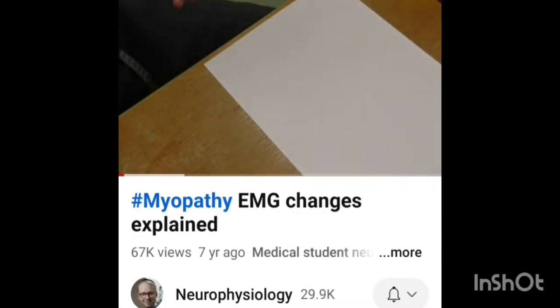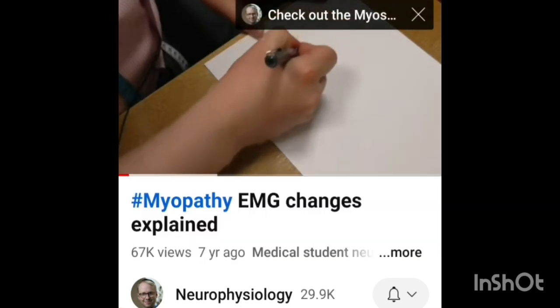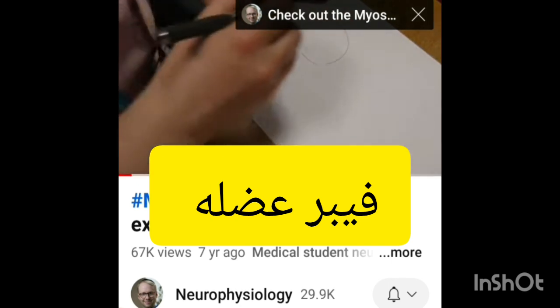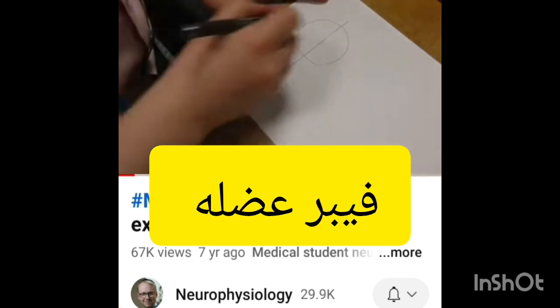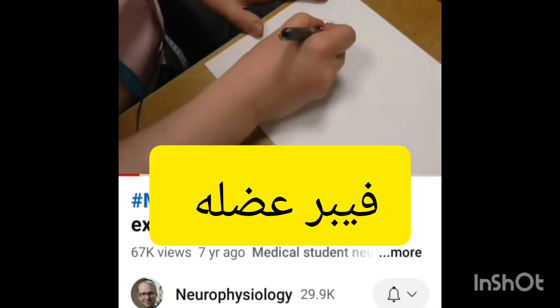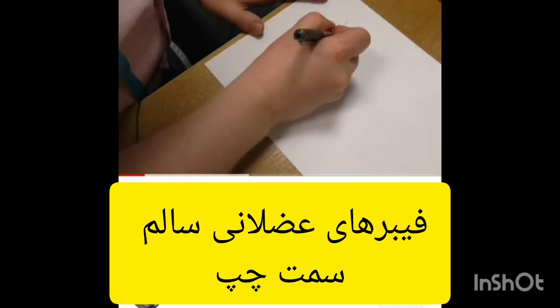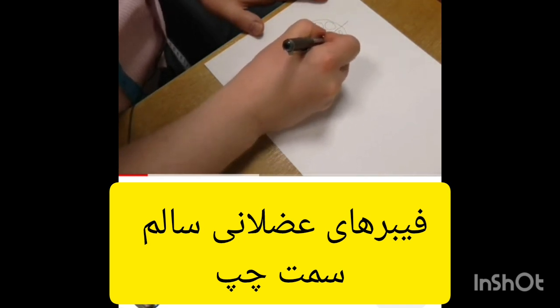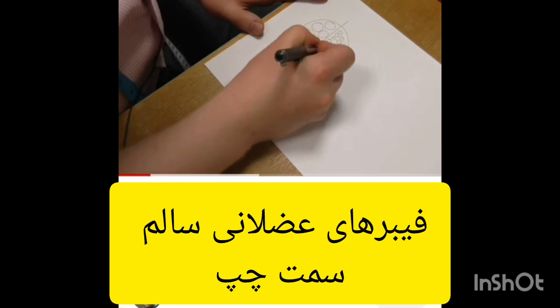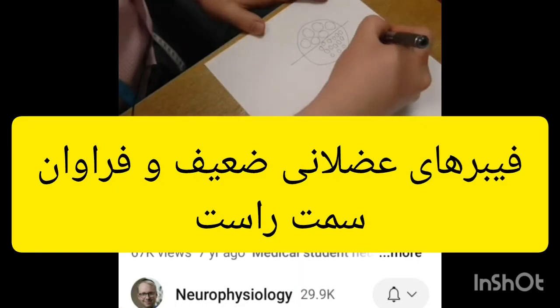In myopathy, the muscle fibers shrink down, and if we just draw this pictorially, imagine this is our field of view. This is the normal side where you've got nice, large, healthy muscle fibers, like so. And on this side, we've got small, shrunken, diseased muscle fibers. Imagine we put our concentric needle electrode over here.